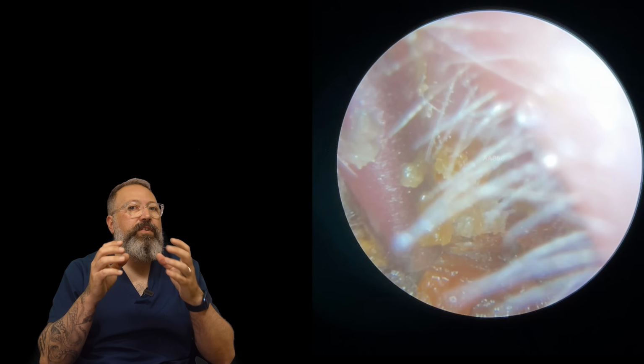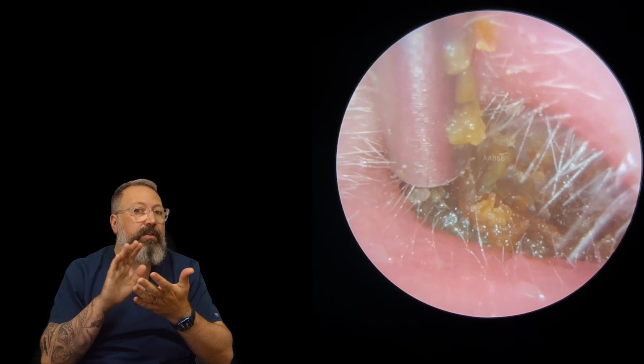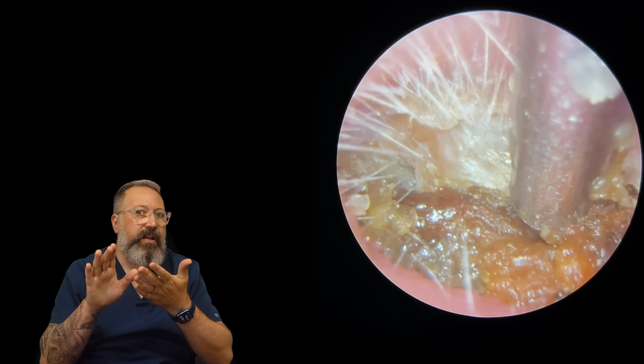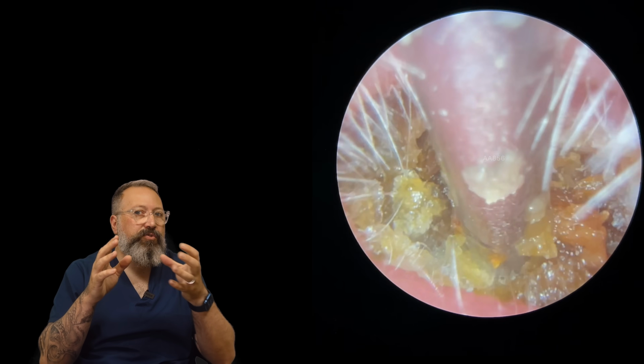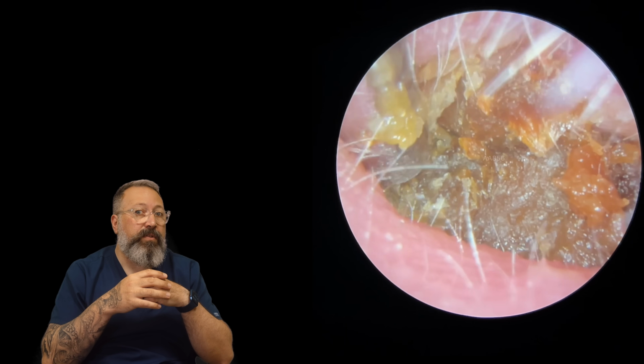I think if we'd put it in as the wax was on initial inspection, the surface would have been so dry, the oil just would have slid straight off the surface and it wouldn't have made any difference at all. But the fact we've broken the surface down a little bit, the oil can just penetrate in. It's not in here for very long, literally a minute or two, and then we're in here with the suction tube.